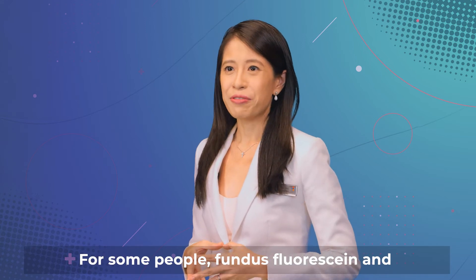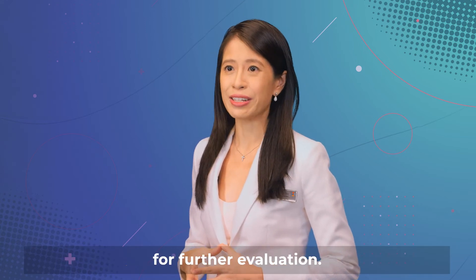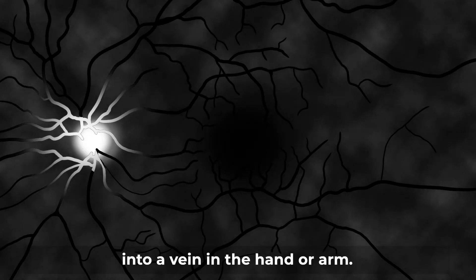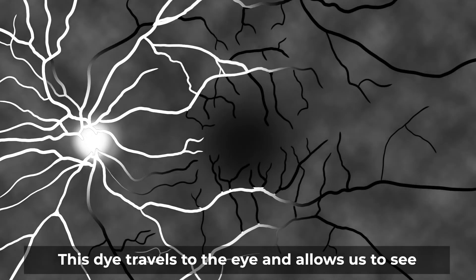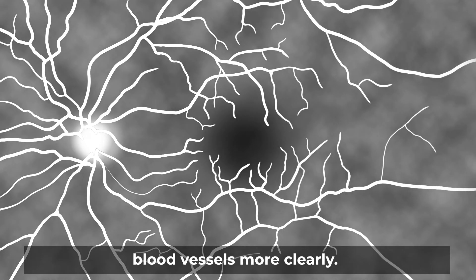For some people, fundus fluorescein and indocyanine green angiography may be required for further evaluation. For both of these tests, a dye is injected into a vein in the hand or arm. This dye travels to the eye and allows us to see blood vessels more clearly.